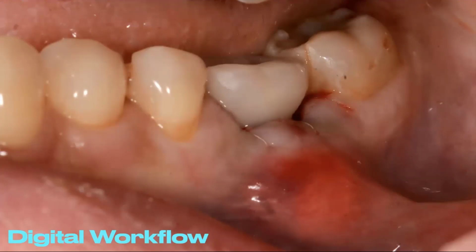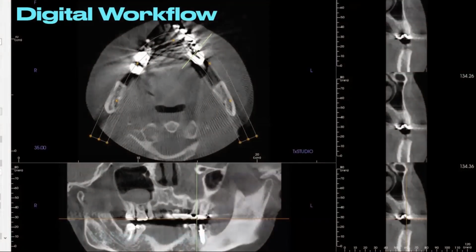And then if you do this all right, you can think about it. They got one sling suture. That's the only suture we put in. Everything else was done through the hole. Everything was done immediately. They got a tooth in one day. And we can verify it.